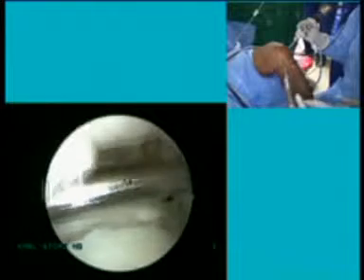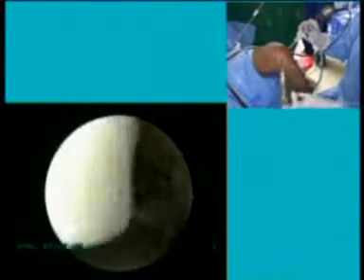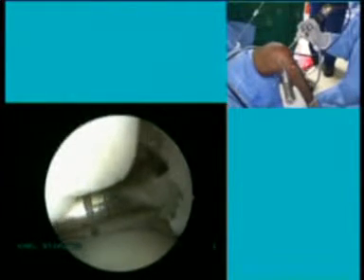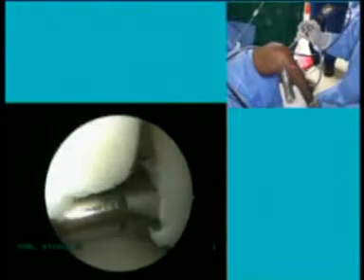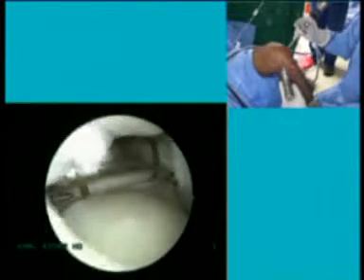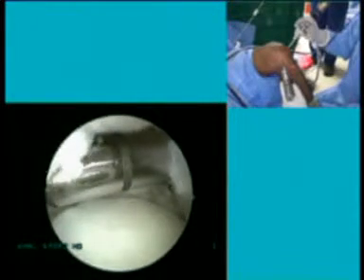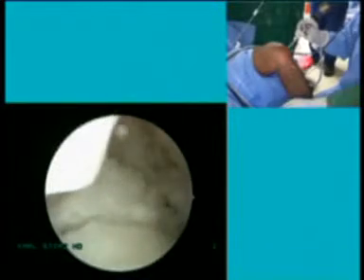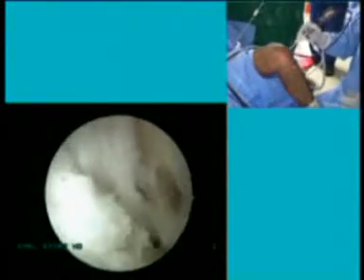Dr. Wolf, there's a question from the audience. How is the jig designed? Are the tunnels divergent or convergent as they exit the femur? They are divergent. No, let me drill this tunnel, and then I can show you, please. Because the aimer is divergent.